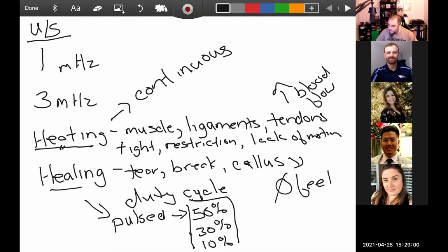And it may take a little bit for everything to kick in and for those ultrasound waves to cause a reaction in your body. It is completely possible to go the whole way up to 50% and not really get much out of it. It just is. Because it may be that for whatever reason, the person just doesn't respond to ultrasound, right? There are people that take allergy meds because they have really bad allergies and they get nothing out of the allergy med except maybe falling asleep. It's just the way we're kind of designed. So it may be that ultrasound's not the modality for them. And maybe we go 7 sessions, we're like, hey, they're not getting anything out of this, and talk to the PT and say, can we try something else?